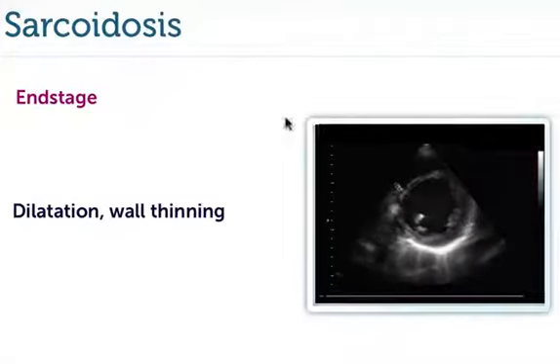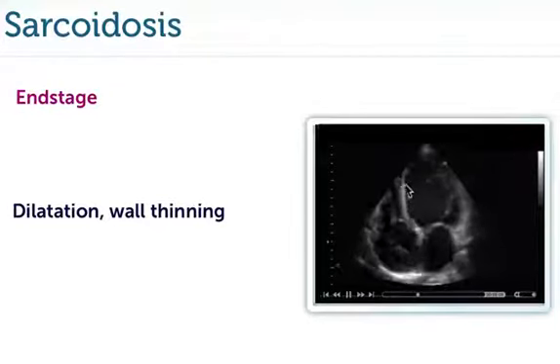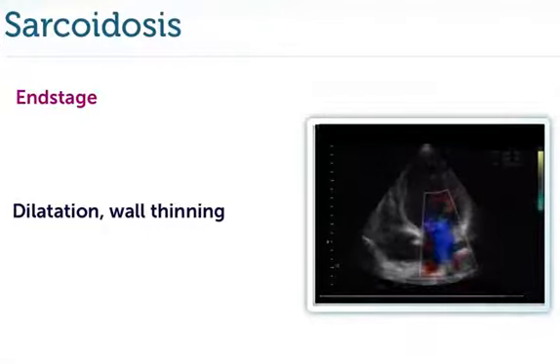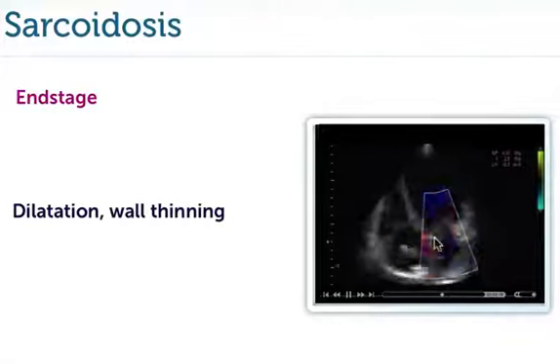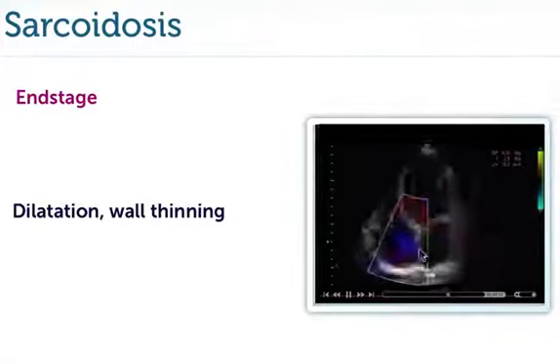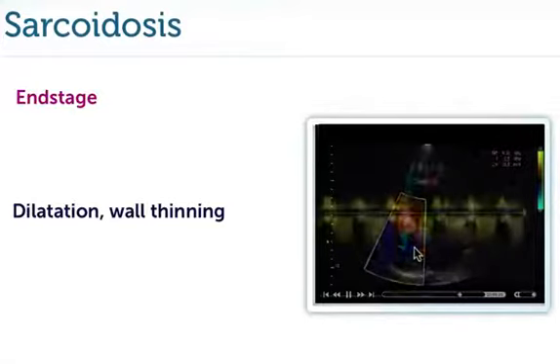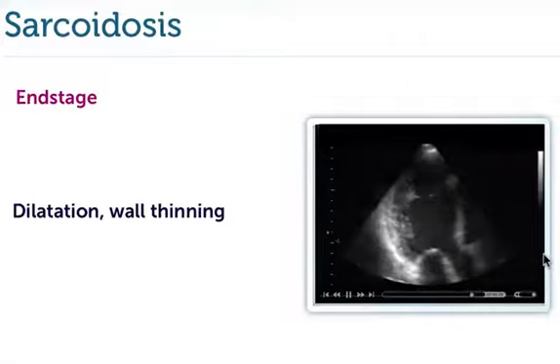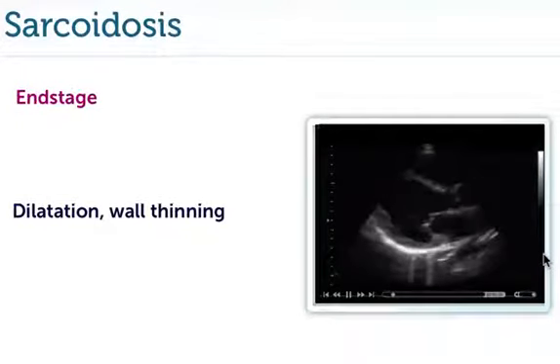You can see the patient has severely reduced left ventricular function with a very thin septum, very similar to a patient who also has dilated cardiomyopathy, some degree of mitral regurgitation and also aortic regurgitation. The patient also has a pacemaker because of conduction abnormalities and significant tricuspid regurgitation with pulmonary hypertension. So in the end stages, a very severe disease, and this patient actually died only shortly after this echocardiogram.